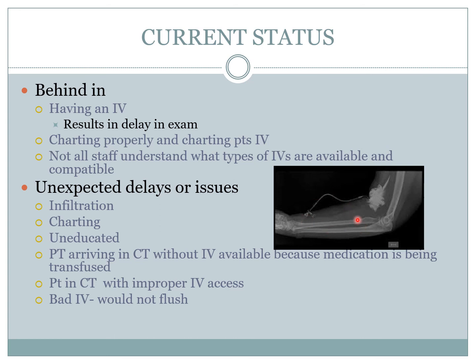Never put an IV on the same place that you need, the anatomy of interest. Never. So if you're concerned about the right arm, the IV needs to be in the left arm, and vice versa. If you're concerned about the left arm, the IV needs to be on the right arm. So that's a dilemma in itself.